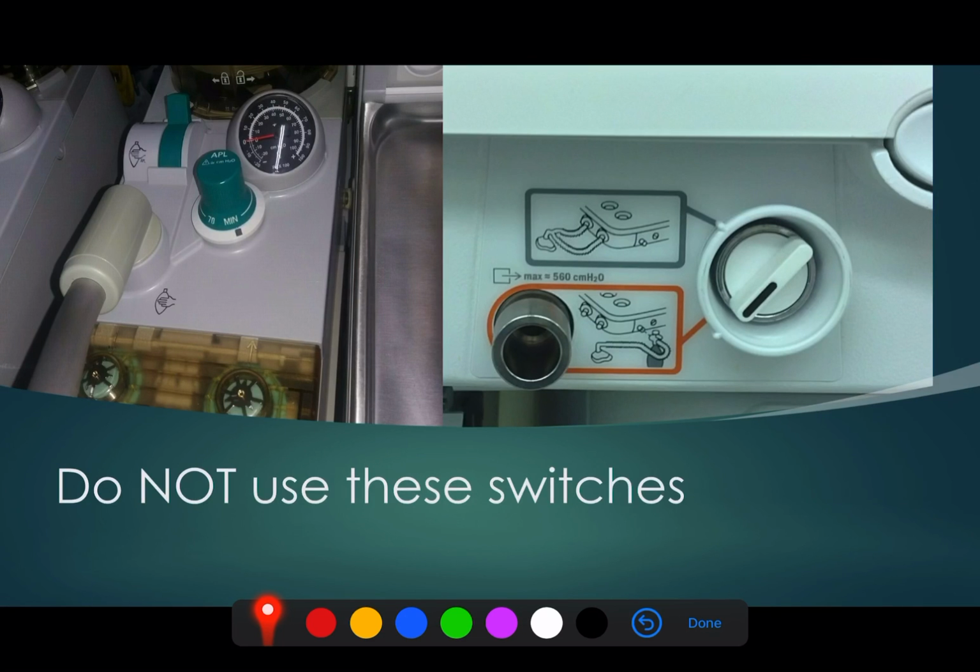Final thing to just know is there are a few buttons just not to touch on an anaesthetic machine. There are a couple of switches that you don't really need to use. The first is what we call the common gas outlet, and it'll look something similar to this. You can turn this dial up, and when you dial it up, it goes into the ventilator. So this is the ventilator tubing. The gas will go through the ventilator tubing and into the patient.